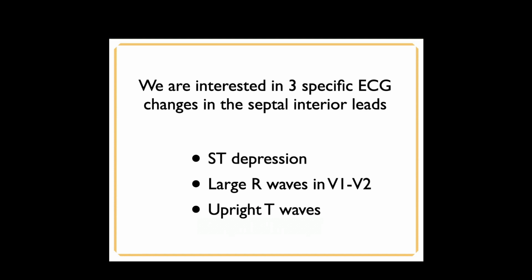So we are interested again in 3 specific ECG changes, and this is in order of importance. The most important is ST depression. The second is large R waves, and then only when it's in conjunction with these, the upright T.